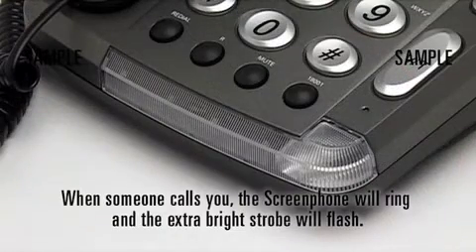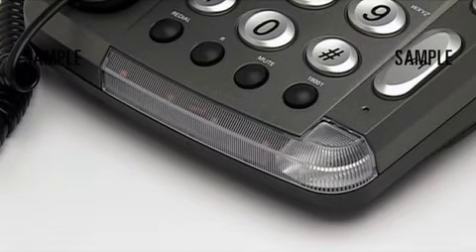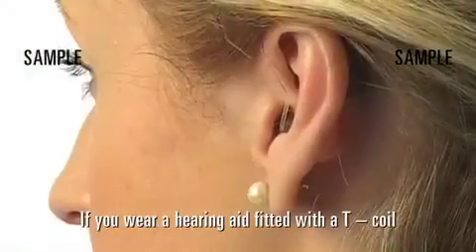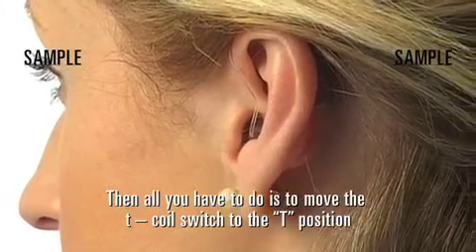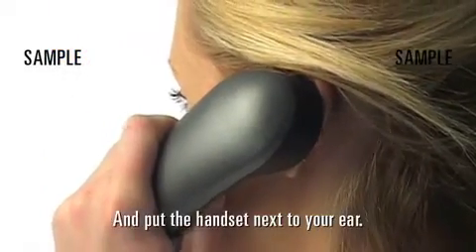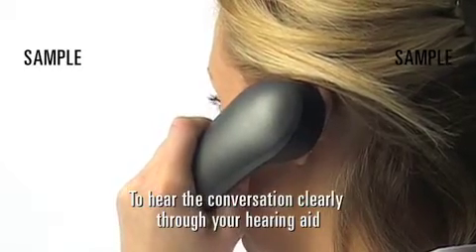When someone calls you, the ScreenPhone will ring and the extra-bright strobe will flash — no more missed calls. If you wear a hearing aid fitted with a T-coil, then all you have to do is move the T-coil switch to the T position and put the handset next to your ear to hear the conversation clearly through your hearing aid.